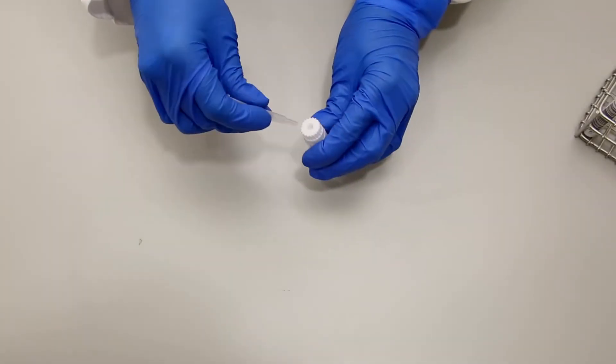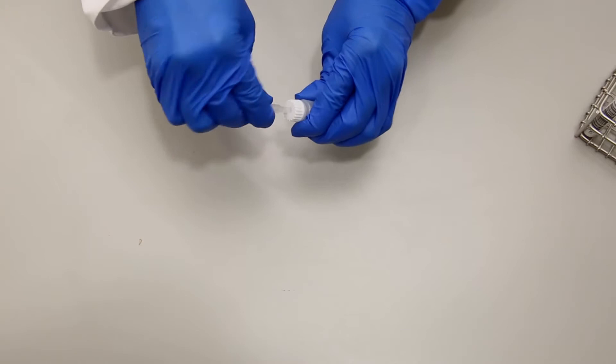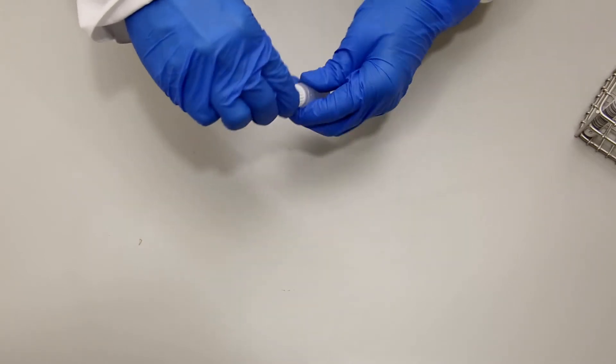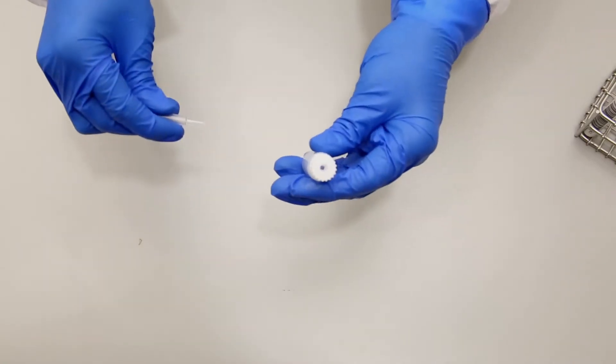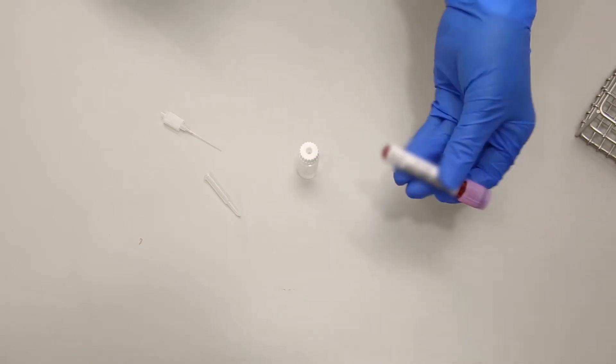There are several manufacturers of whole blood diluting systems used for manual white blood cell and platelet counts available. The system demonstrated in this video is the BMP LeukoCheck system.